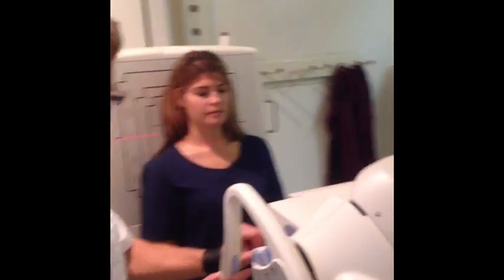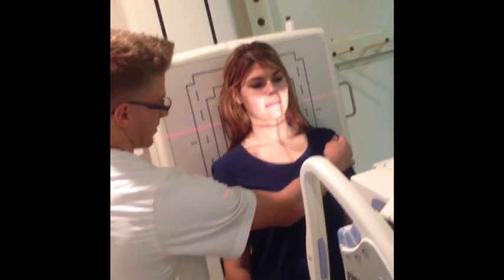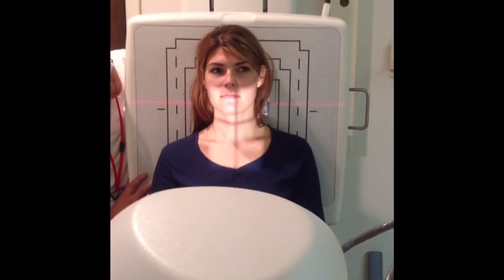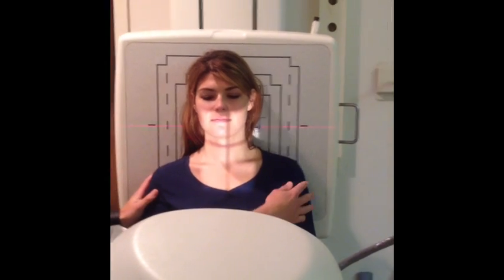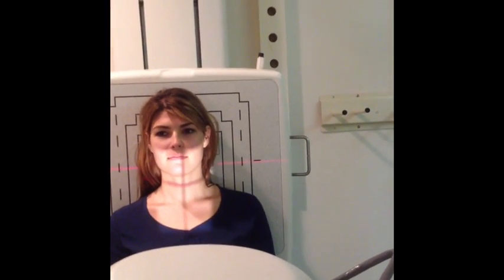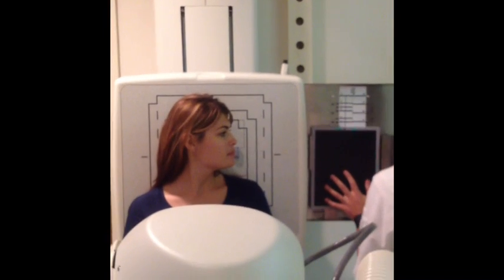Close your eyes for me — I just didn't want you to be blinded. Step towards me just slightly. I'm going to move my bucky up. Go ahead and put your chin up for me. And x-ray. Grab a new film — it's going to be another 8x10, put that in vertical.